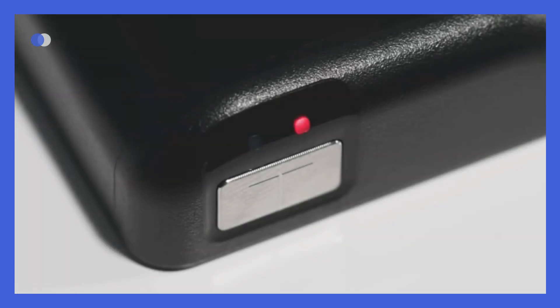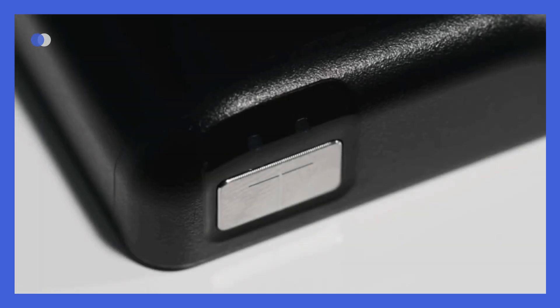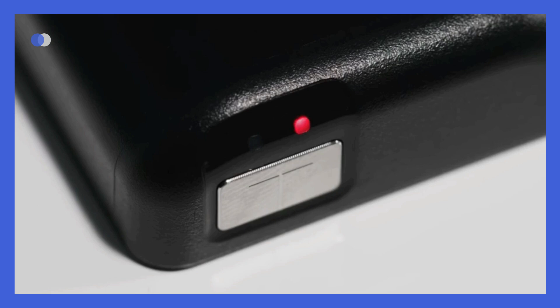If your pump power is very low, one light will blink red, or it may not turn on. It is recommended to avoid fully draining the battery and charging the pump daily for a short period of time, like 10 to 15 minutes. The pump will work normally while it is charging so you don't need to disconnect if you don't want to. However, if you do disconnect while charging, you may need to replace missed basal insulin.